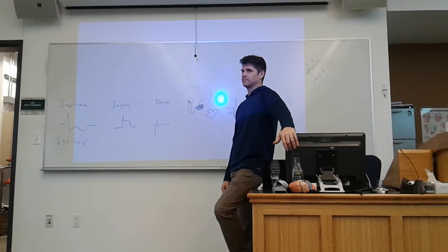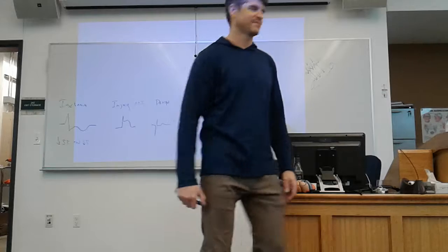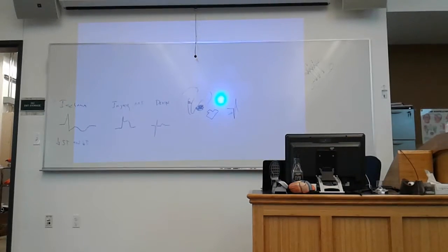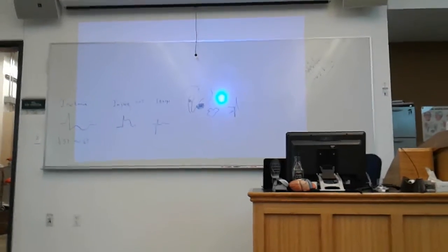Good question. So how would hypoxic blood, I guess it starts peripherally and then works its way in. How hypoxic would you have to be before it affects the heart? Or how long, I guess?